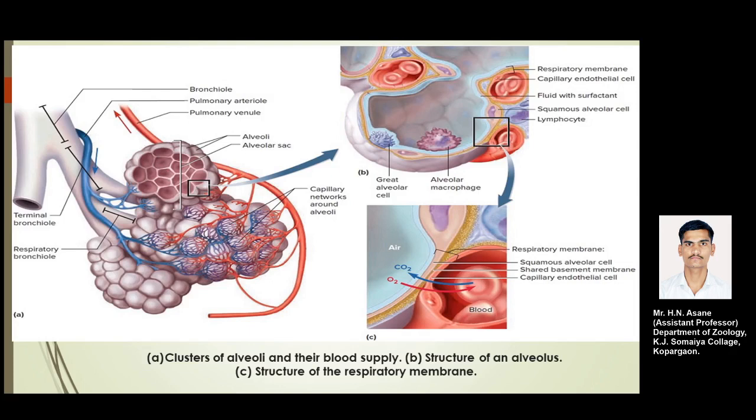Okay, that's the third segment. The respiratory bronchioles differ from the ordinary bronchioles, as they have no cartilage, and the epithelial cells of these respiratory bronchioles are cuboidal and non-ciliated. Okay, so the goblet cells are present. Oh, sorry, goblet cells are absent over the respiratory bronchioles over here.